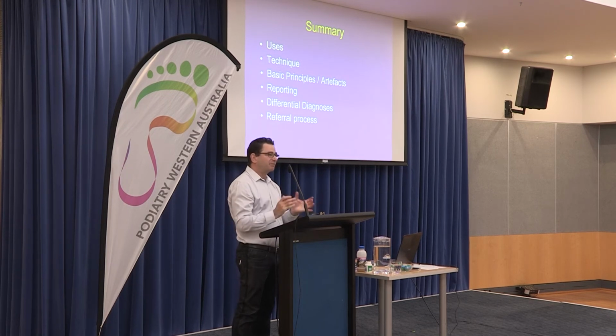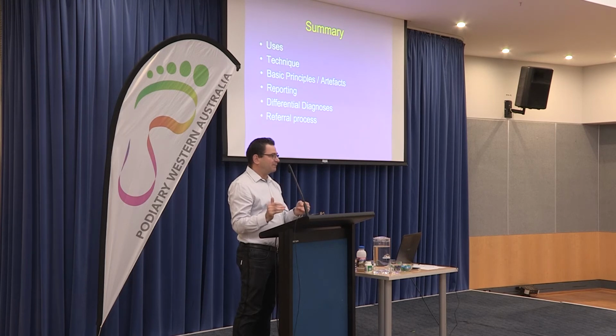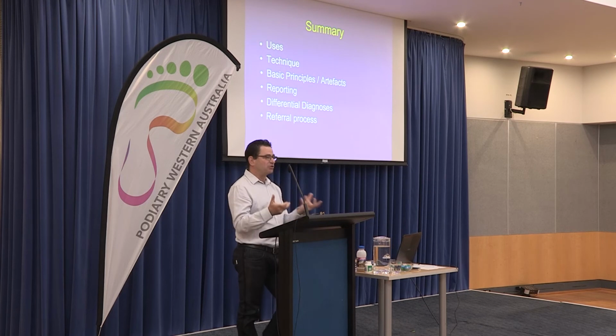Sometimes people think that ultrasound is a poor man's MR, but in actual fact, they're quite complementary studies too, because you can't do anything dynamic in MR. They're just lying there flat on the table, whereas you can do a whole lot of stuff.